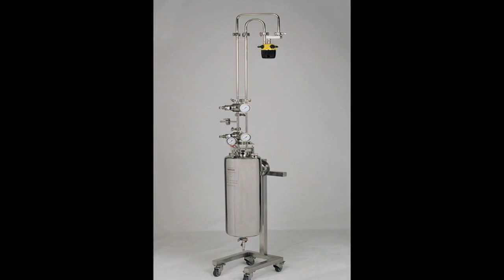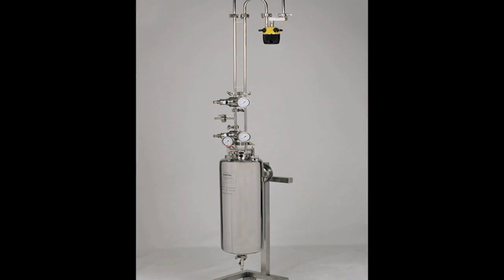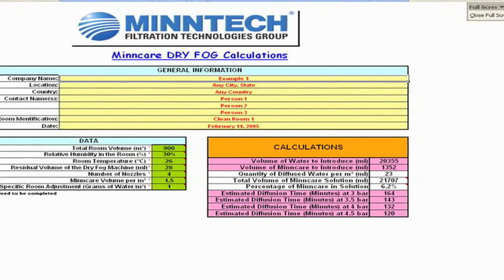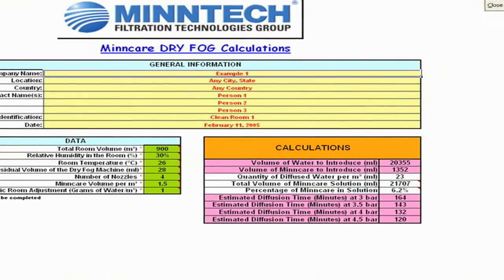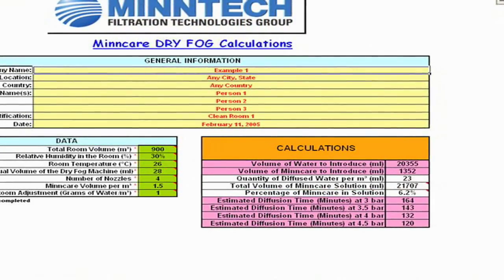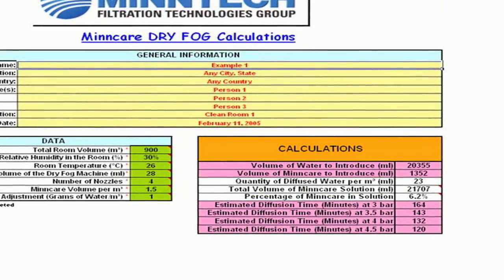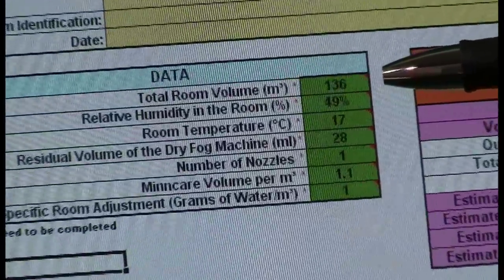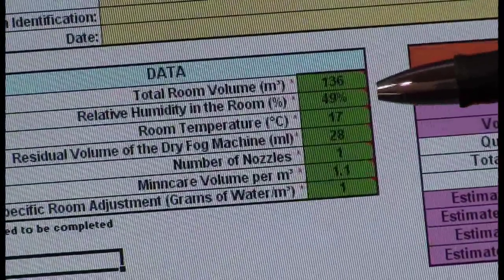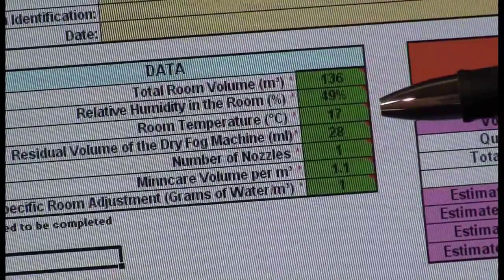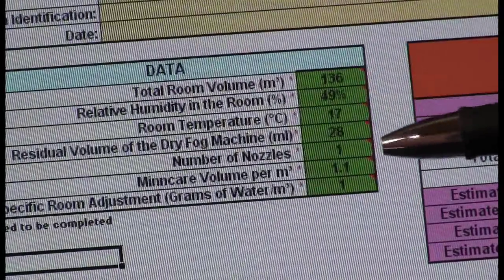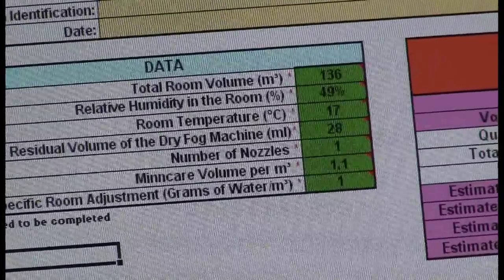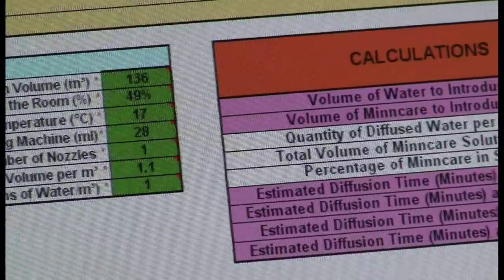Now that we've got our dry fog machine assembled, it's ready to calculate the parameters for your application. With this simple Excel based program that we supply, everything is done for you with the exception of putting in the inputs. So what we calculate here, total room volume in cubic meters or cubic feet converted to cubic meters, relative humidity and temperature at the time of fogging.